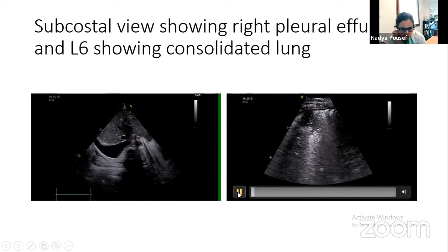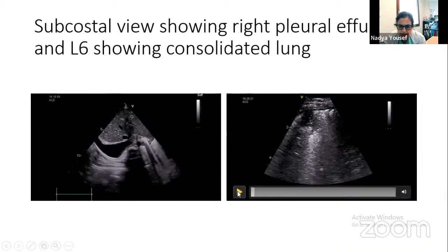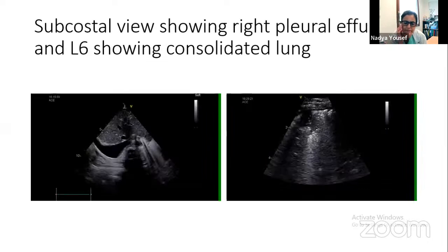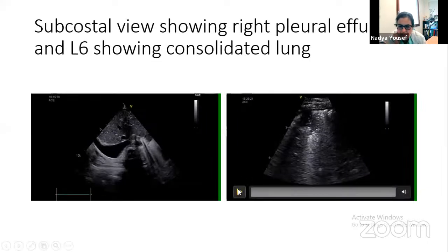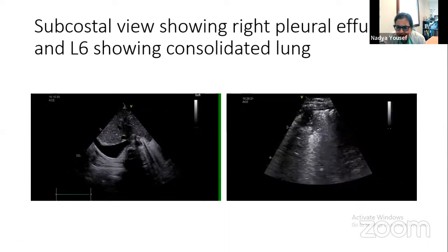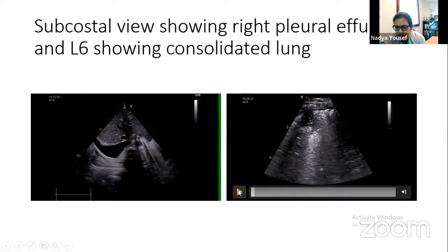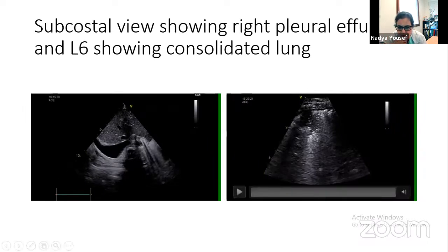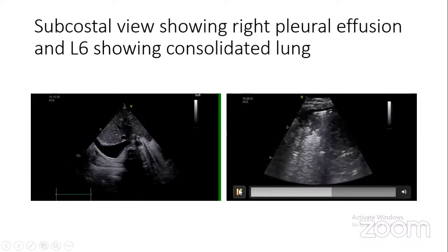Maybe if we had seen the clip, it would also be easier for us to see. But in any case, the question is whether these hyperechoic areas are more the equivalent of bronchograms, or the opening up, let's say, of a consolidated lung tissue. And yeah, there is some shred sign though, Dr. Atnafou, when you see it goes down there on the left side of the screen when the clip moves. So there is some degree of shred sign that we don't see all the time. And this was done with a phased array probe, I suppose, which is why we're seeing this clip a bit differently. But it would be interesting to see how that follows up.